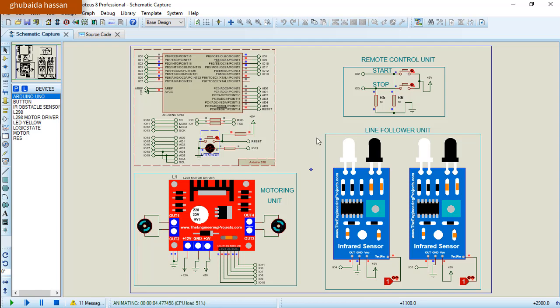Wow, the motors. Okay, sorry. Okay, so they are rotating. Pretty good. To stop the wheelchair, sorry, there is some delay. I don't know why, but I think it's nothing, and it works fine. To stop the wheelchair, we'll just need to click this button here, just stop. Wow, then let us start it again. Wow, it's working pretty fine.